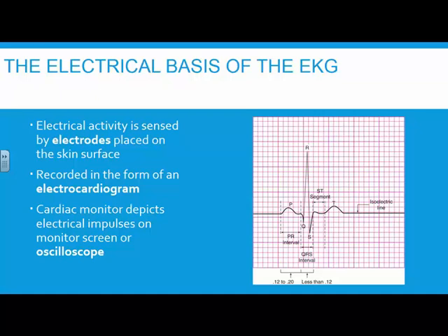Then he took a light and cut a hole, and it's kind of hard to see here, he took a light and cut a hole in that magnet. He had the silver wire in between the two poles. He had the leads hooked up to the patient. Then he put the EKG recording paper, very rudimentary, very elementary, just a very, very basic EKG monitor. Each time the patient's heart beat, that silver wire would twitch. The light going through the poles of the magnet would actually burn onto the paper, and it would give you a very basic tracing. I don't know if that's the word. At that point, that's where they started determining that they could record the EKG.